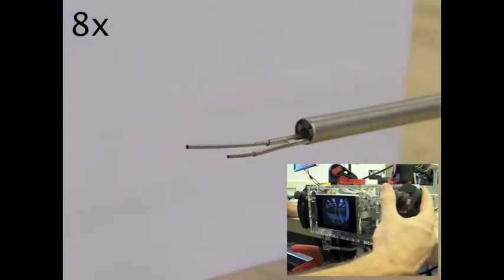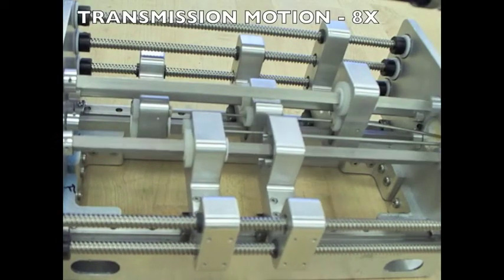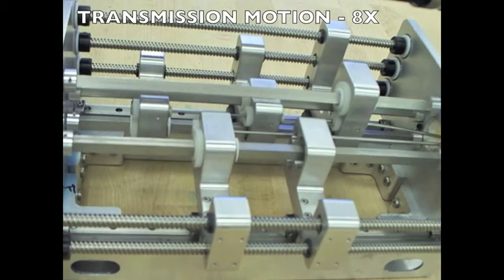In the transmission section, lead screws translate carriers, which move the tubes in and out, while square shafts transmit torque to each tube to provide rotation.